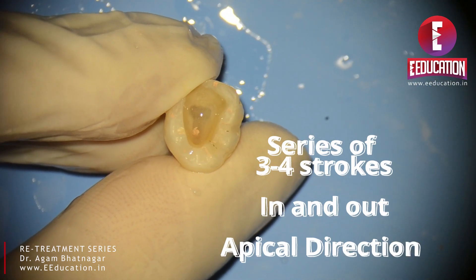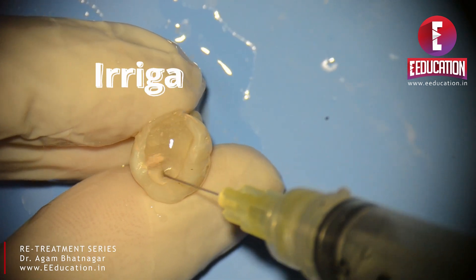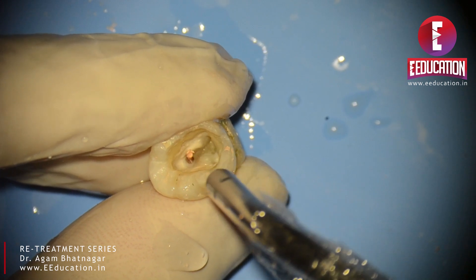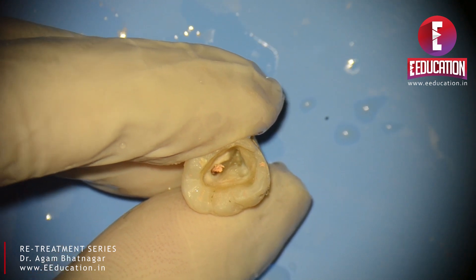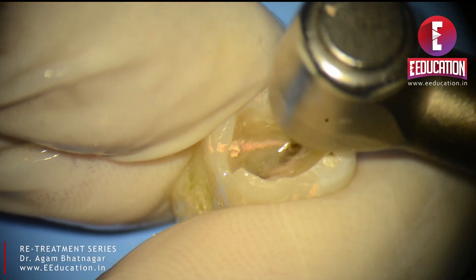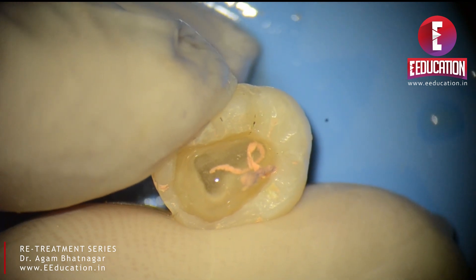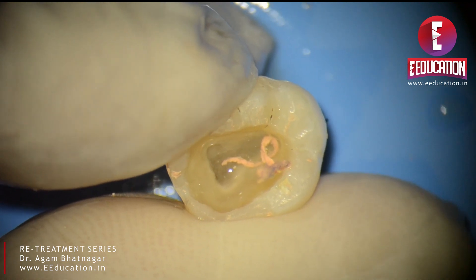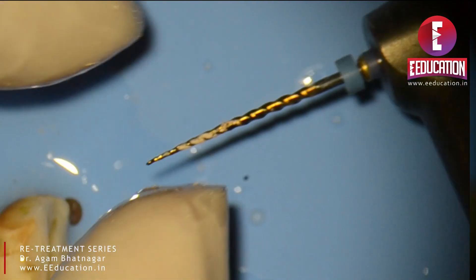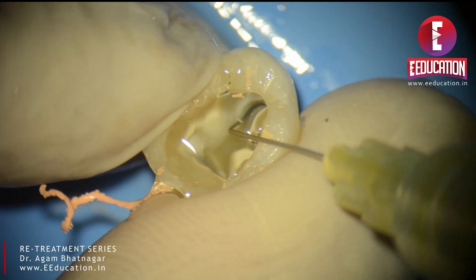We are currently trying this at about 550 RPM and a torque of about 3. Irrigation is a key part of both primary and retreatment procedures. You can see small flakes of gutta percha coming out. If you do not irrigate well, you will end up pushing fine particles in a more apical direction. In the space created between the gutta percha and the canal wall, insert the HyFlex Remover with the same in-and-out motion, engaging the GP with minimal apical pressure. You cannot afford to push debris back into the canal.